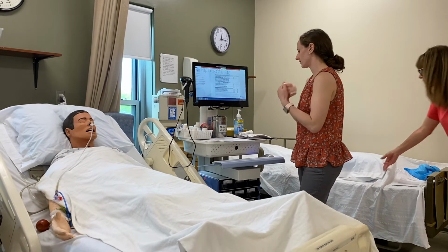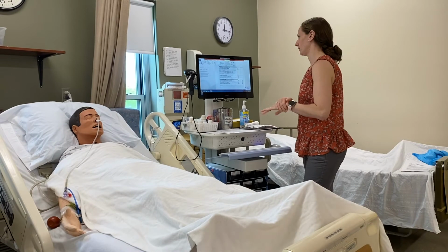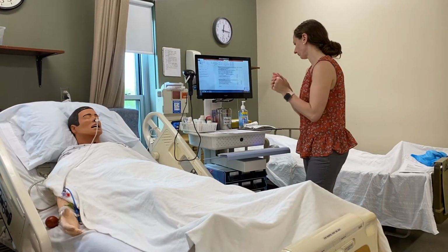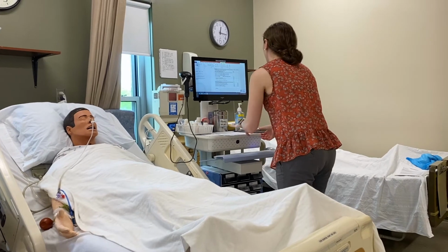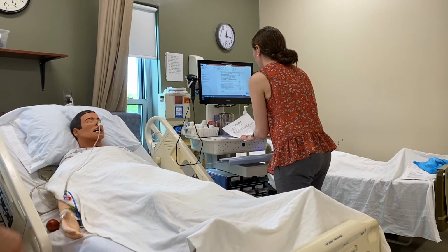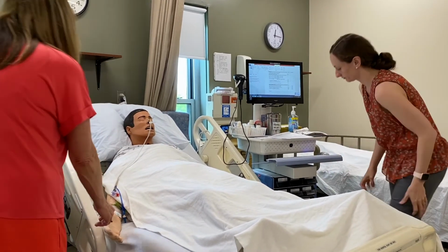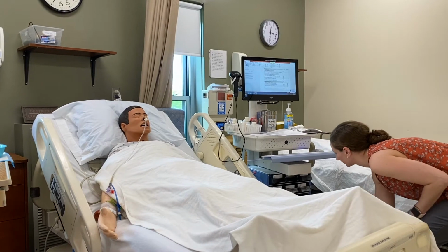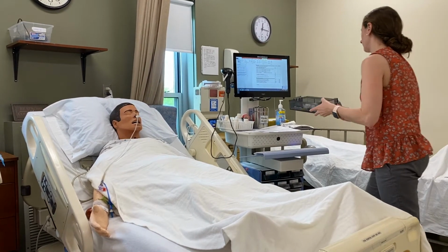So first I'd start preparing my meds in the med room. Yes, you would. And I'm going to prepare medications for Francis Red 3170. Francis Red 3170. Once we get to the room, we'll check it again. Francis Red 3170. Okay.